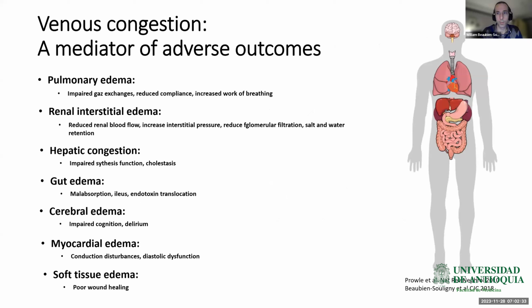If you see here the different patterns, pattern 0 or 1, which is usually considered normal, pattern 2, which is biphasic flow, pattern 3, which is only flow during diastole. You can see that if we consider the renal venous stasis index, there is some overlap, but the monophasic flow pattern is usually much more severe.